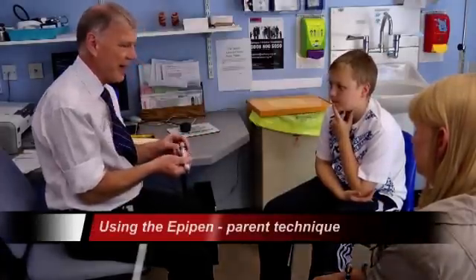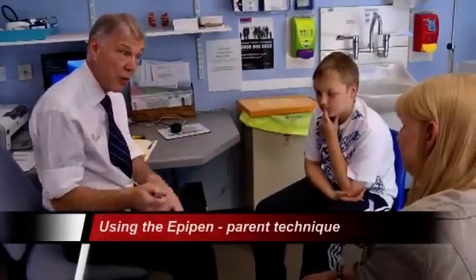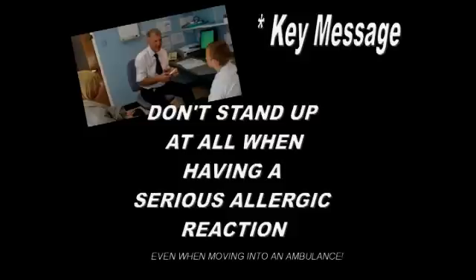Now, Mum, I'm just going to explain to you how it would work if you were giving the EpiPen. I've shown you on myself; now I'm going to pretend I'm dad and I'm giving it to Oliver. Oliver has got breathing difficulties, so I have him sitting down. It's really important that he does not stand up at all during an anaphylactic reaction, because his blood pressure can fall very suddenly.